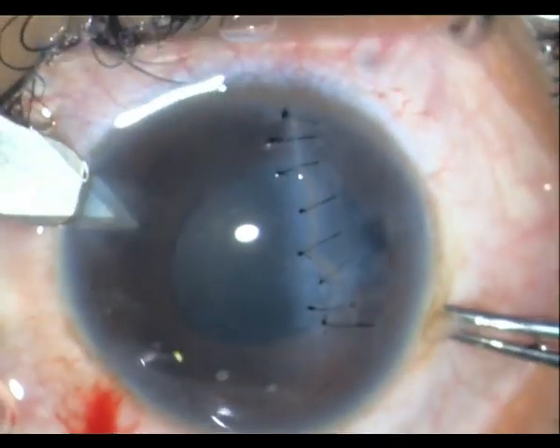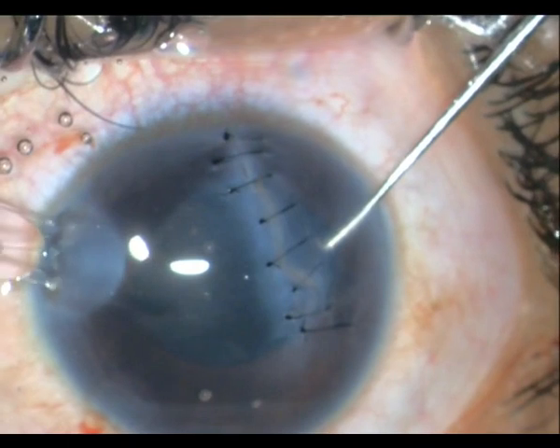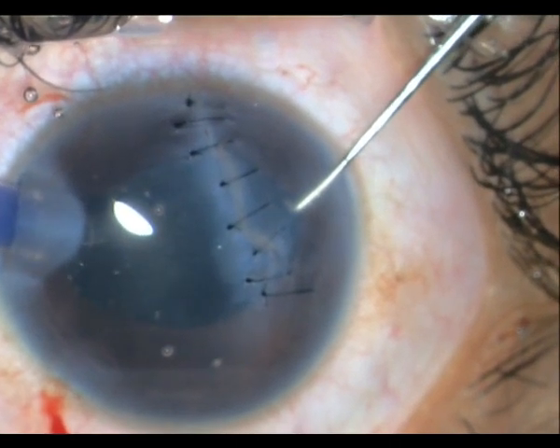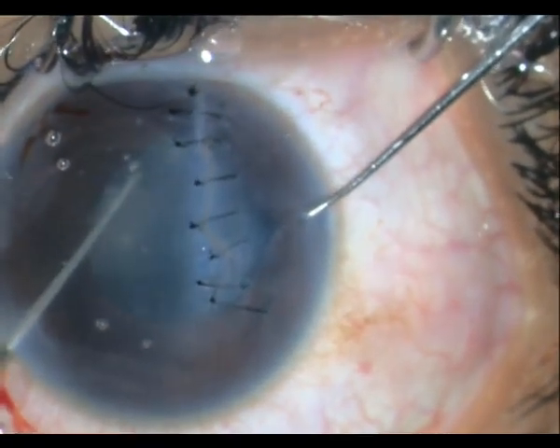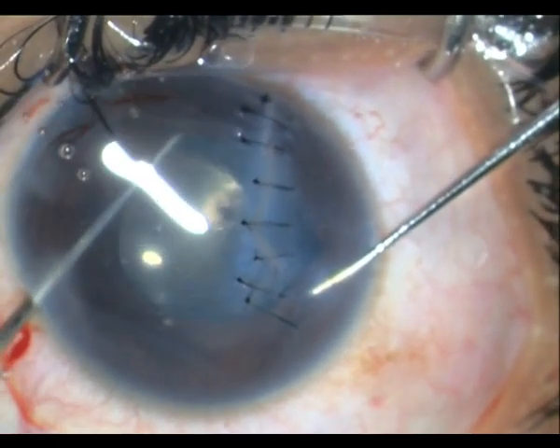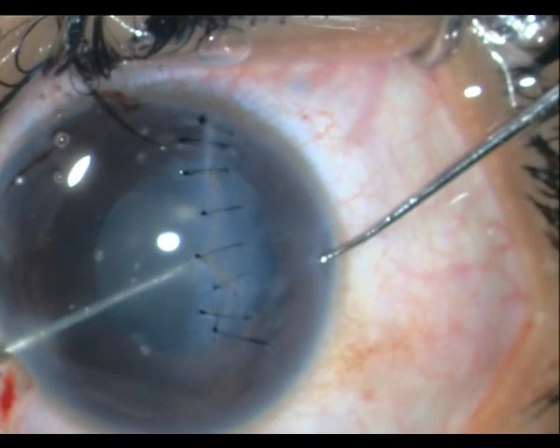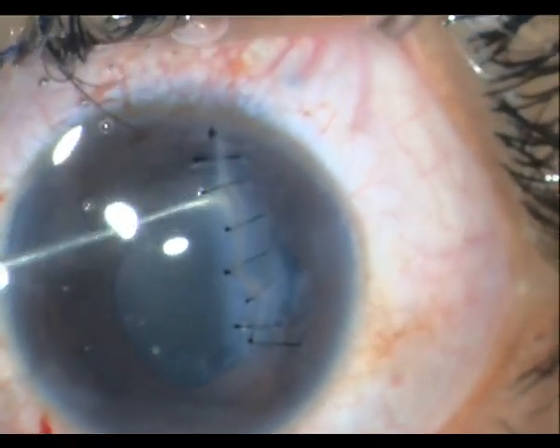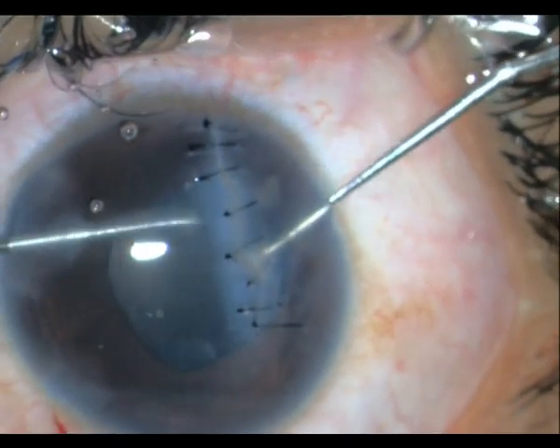Once I am satisfied that I have removed all the cortex, I extend one of the paracentesis wounds with my 2.8 blade and place a foldable single-piece IOL within the bag. I know I have an adequate rhexis. I did not have to go for a three-piece lens, although that would have been, I think, a better decision. However, I have already gone in with a single piece and I have to make do with this. It is an effort to get the trailing haptic into the bag, especially since I cannot see really well under these circumstances.